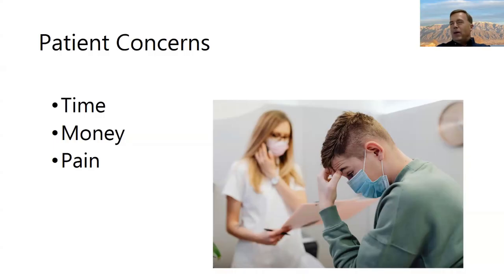I have a bad example of this that I want to use to illustrate how not to do it. So I was in Baltimore supporting a lower All-on-X case, and the patient had already had an upper. We were doing the lower guided, but the upper had been a freehand with a denture conversion.